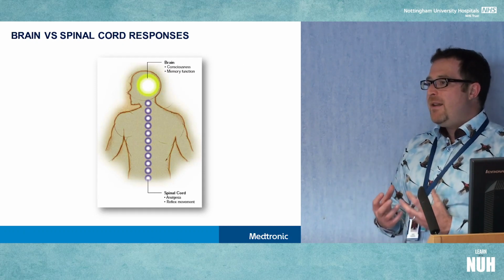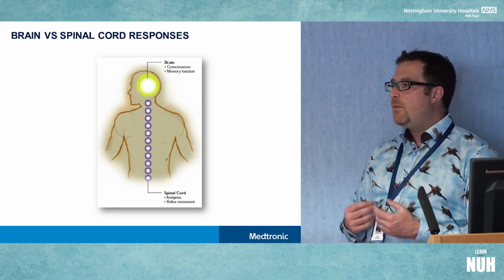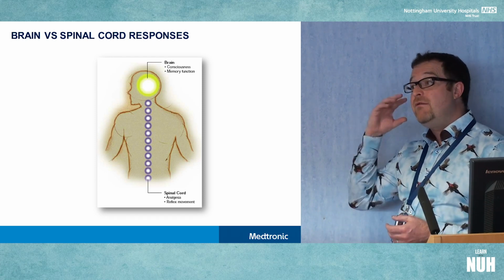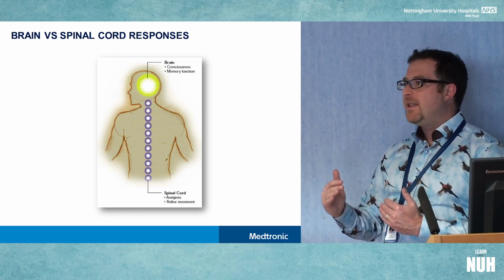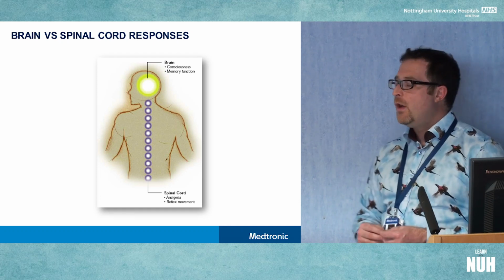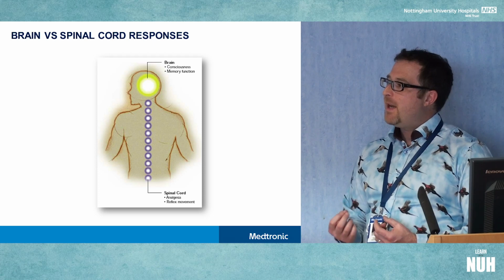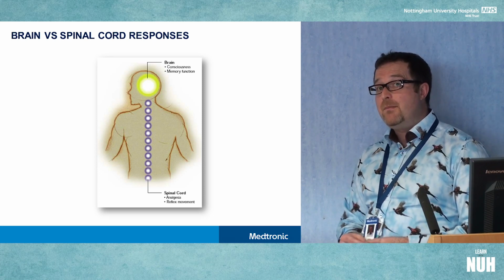BIS is really there to help you understand your relative hypnotic level in a way that your MAC and your TIVA algorithms, target effect concentrations, can't do. You're looking directly at the brain and anaesthetic sensitivity or insensitivity, which varies quite significantly per patient. What BIS can't do is tell you whether the patient's awake or asleep. This is why your expectations need to be set realistically when you're using something like BIS.